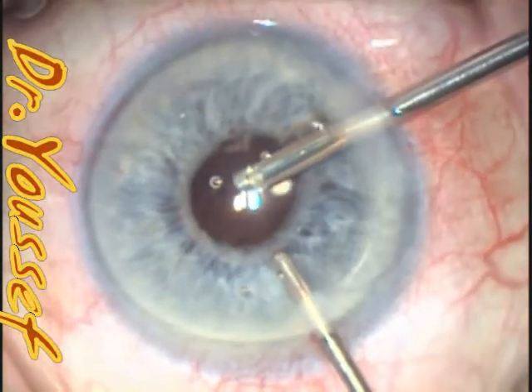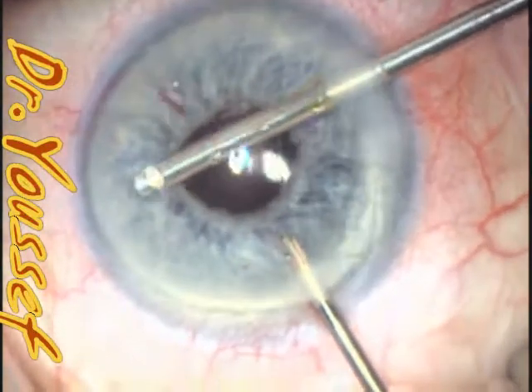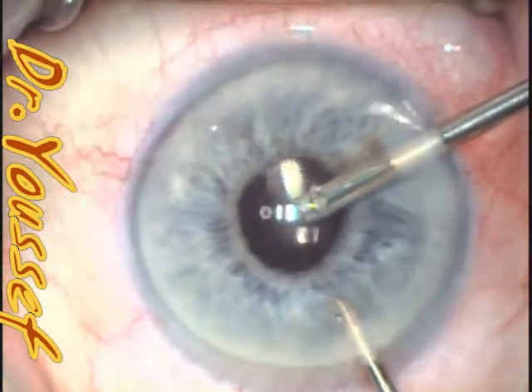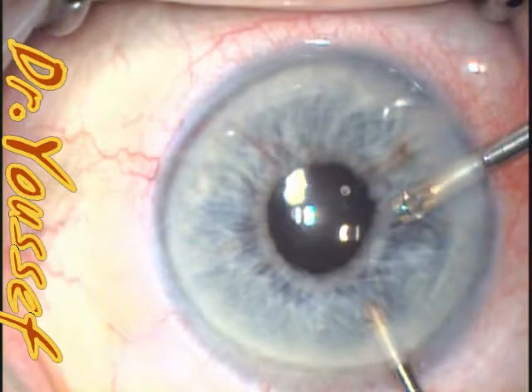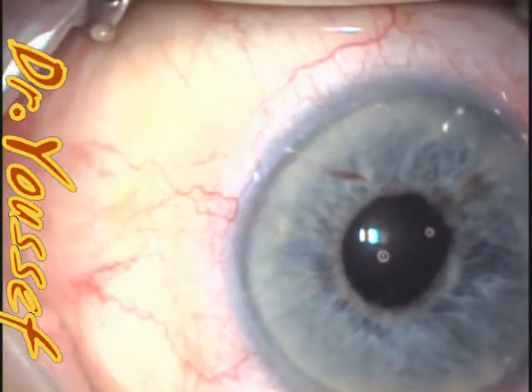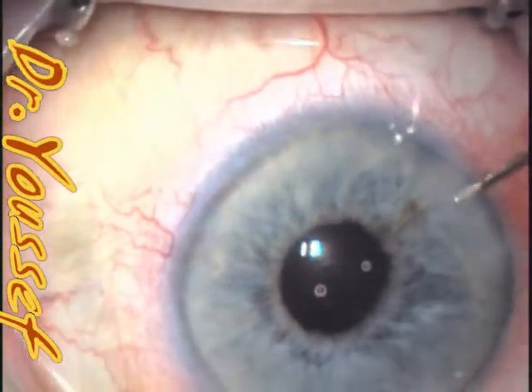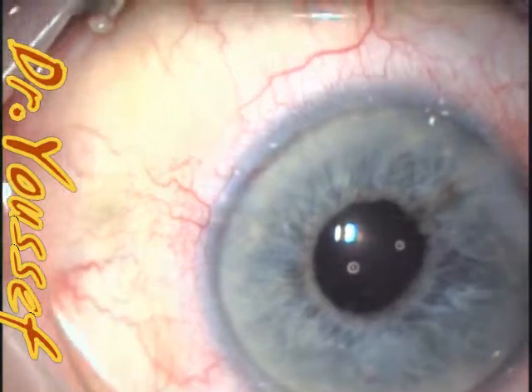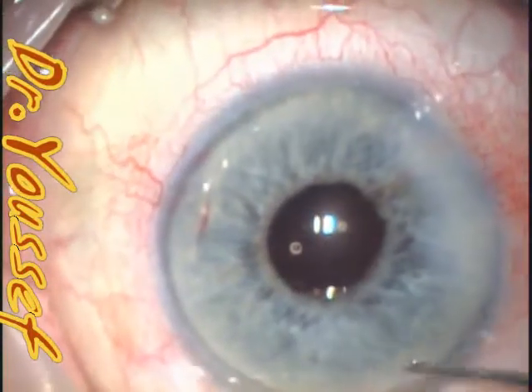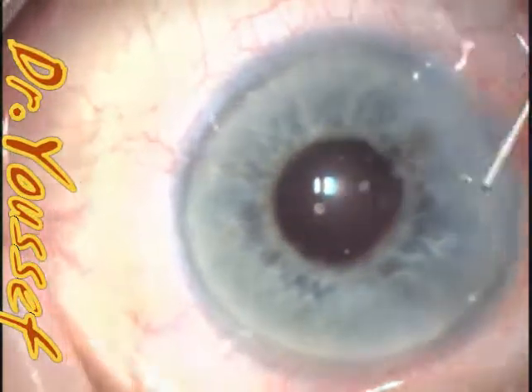So despite having this small complication, still the results are good, and the patient had 20/20 vision after the surgery. I see the patient the same day after surgery. Results are good. I'll hydrate the wounds as usual using Avelox, which is a 4th generation quinolone, injecting into the wound, both sides, and part of it goes into the anterior chamber, intracameral.